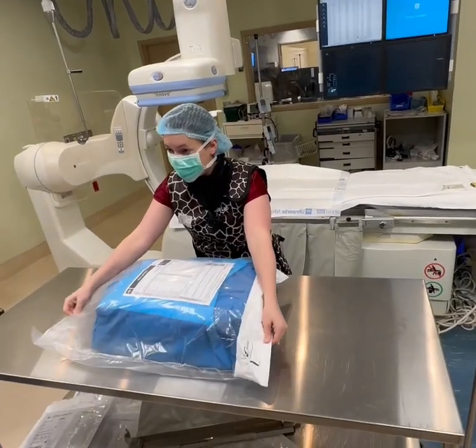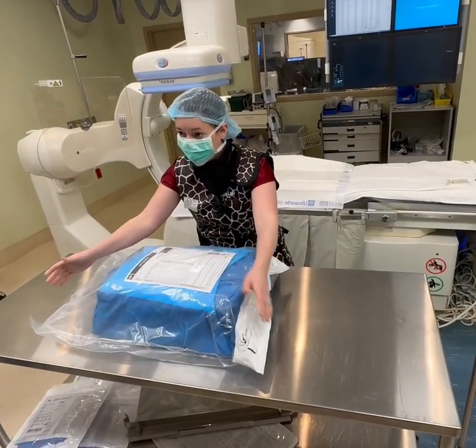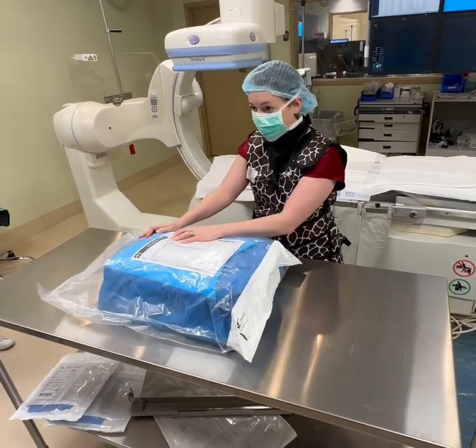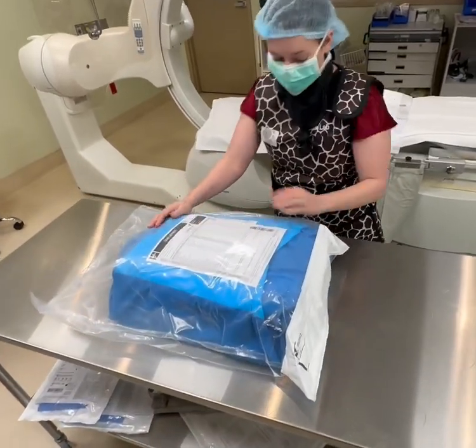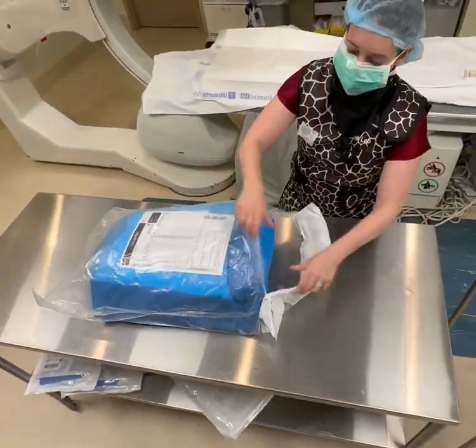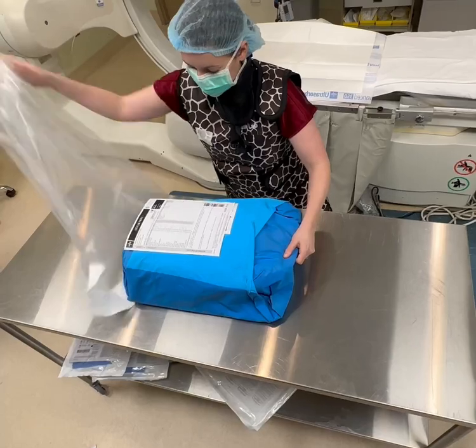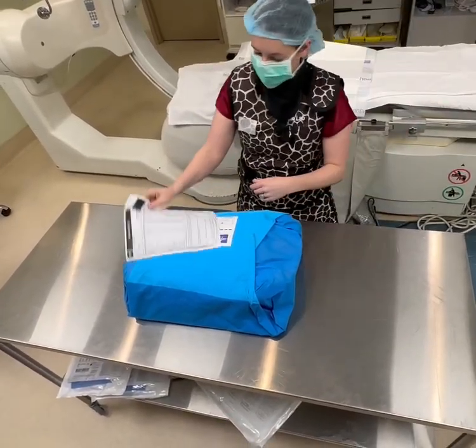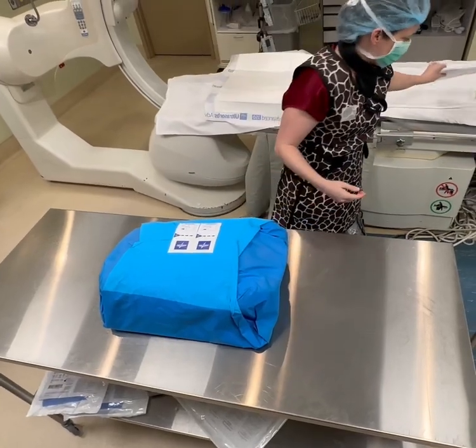It better not have any tears, defects in it. Maybe it got cut while they were opening the box. I'm going to check the expiration date to make sure that it's still good, okay? All right, so I'm going to open it. Pull it out. This is trash. Keep your inventory sheet in case anything's missing.